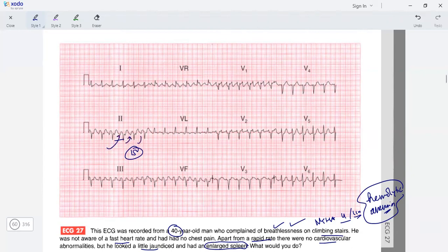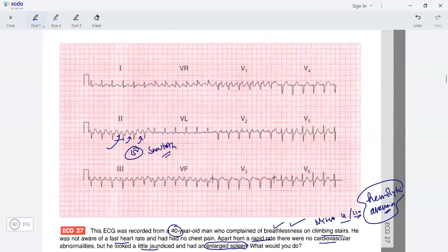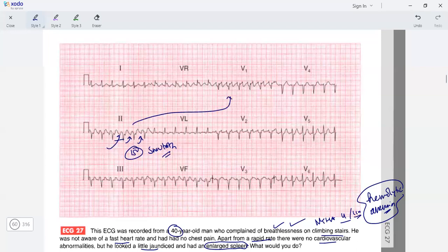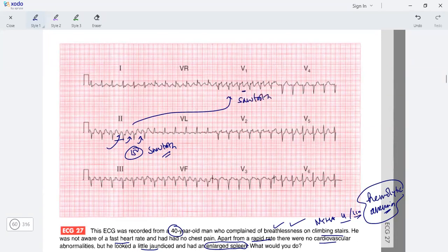Looking at V1, V1 has a classic sawtooth P wave. I got my diagnosis: this is atrial flutter. As the rate is around 150, this must be atrial flutter with 2:1 AV block. This is atrial flutter with 2:1 AV block.